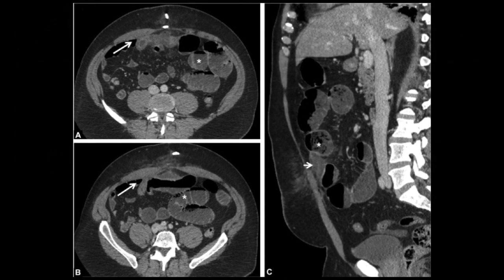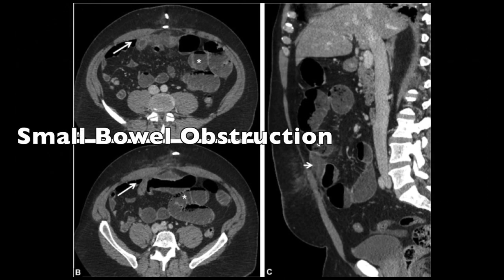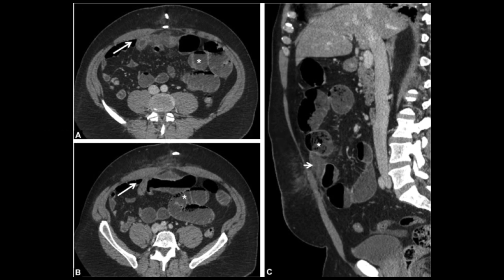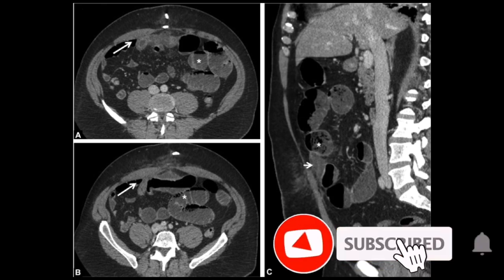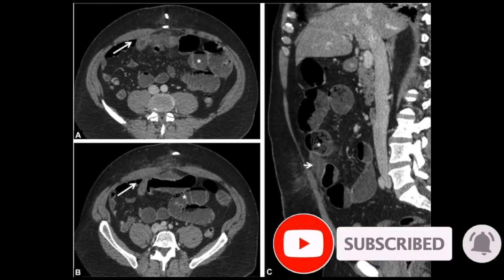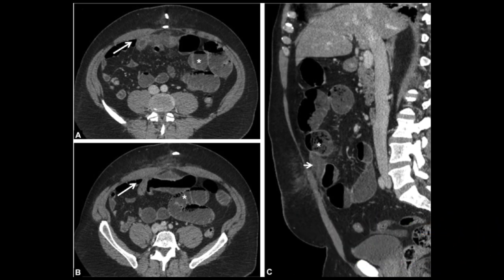The next case is a small bowel obstruction. This patient had cramping and vomiting a few days after umbilical hernia repair with an intraperitoneal mesh, VentralEx. We see dilated small bowel loops with the transition zone close to the operative site, seen by the long arrow. There is also a fluid collection between the bowel loops and abdominal wall seen on the right-hand image. The mesh was not radiographically visible.